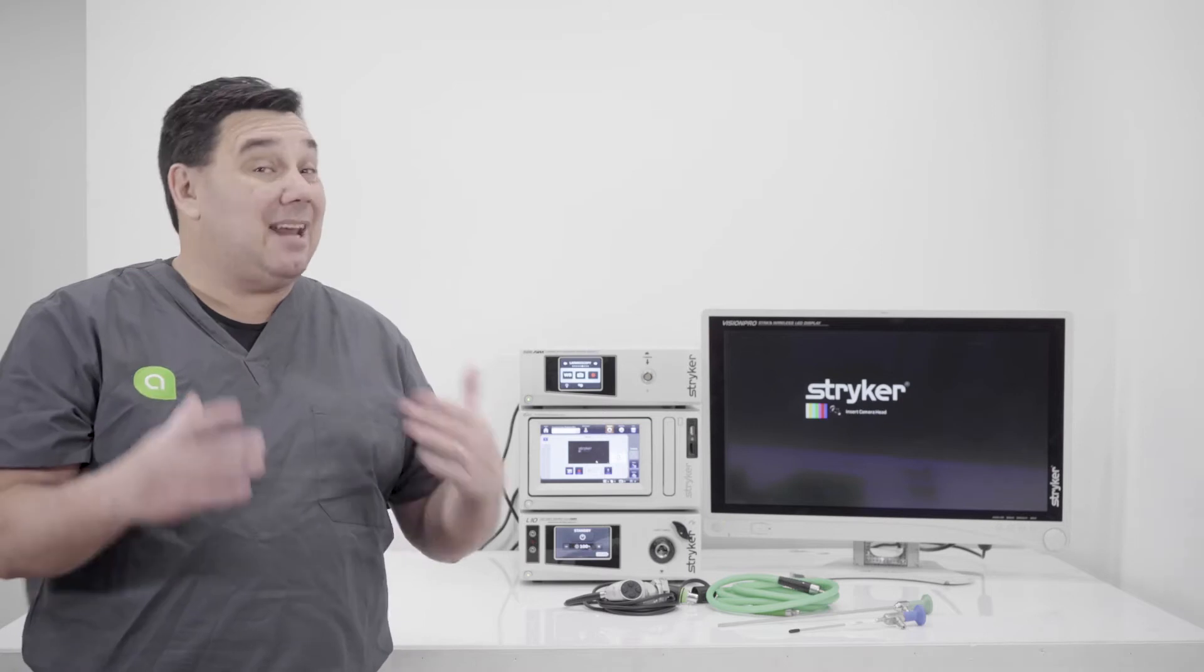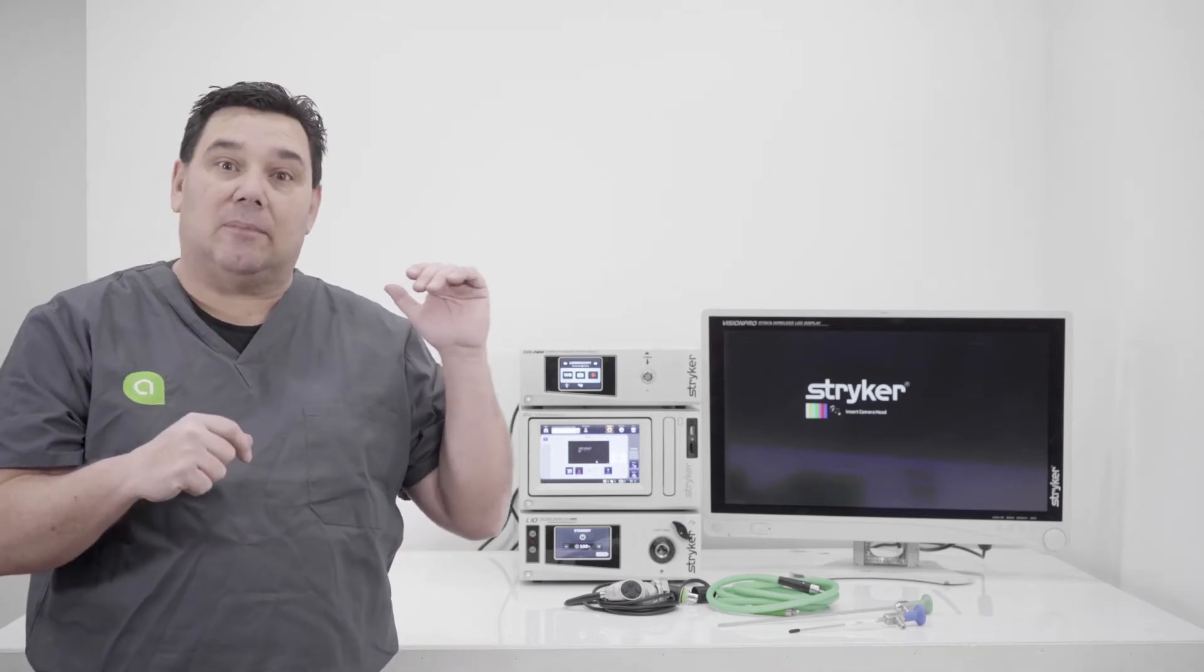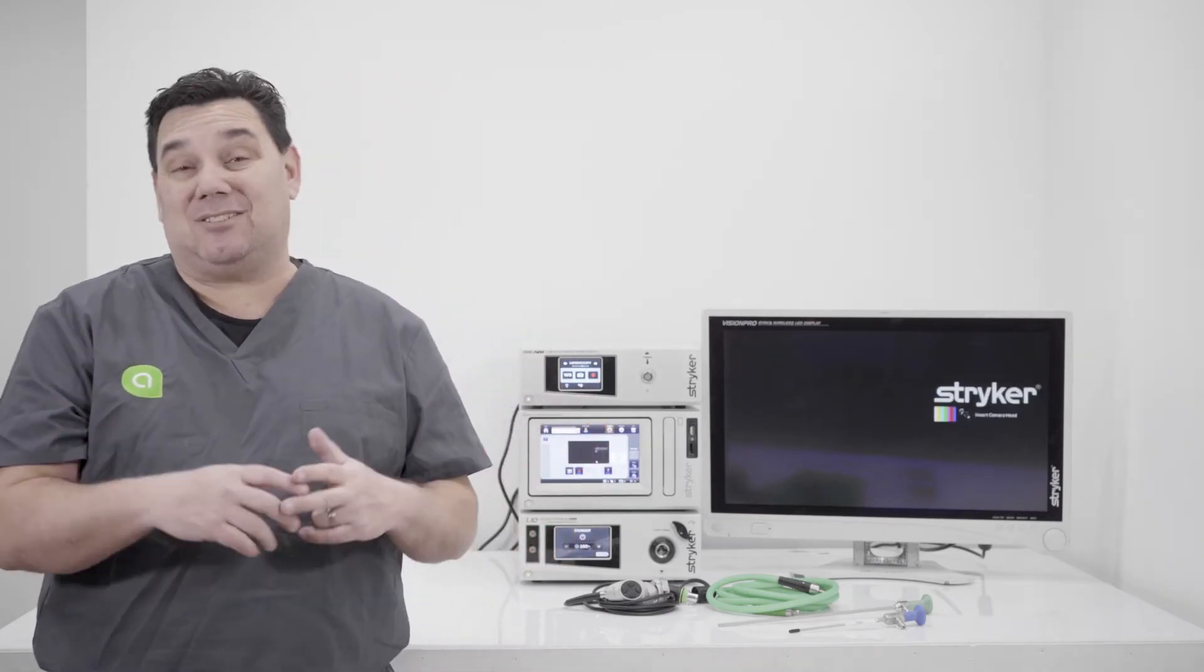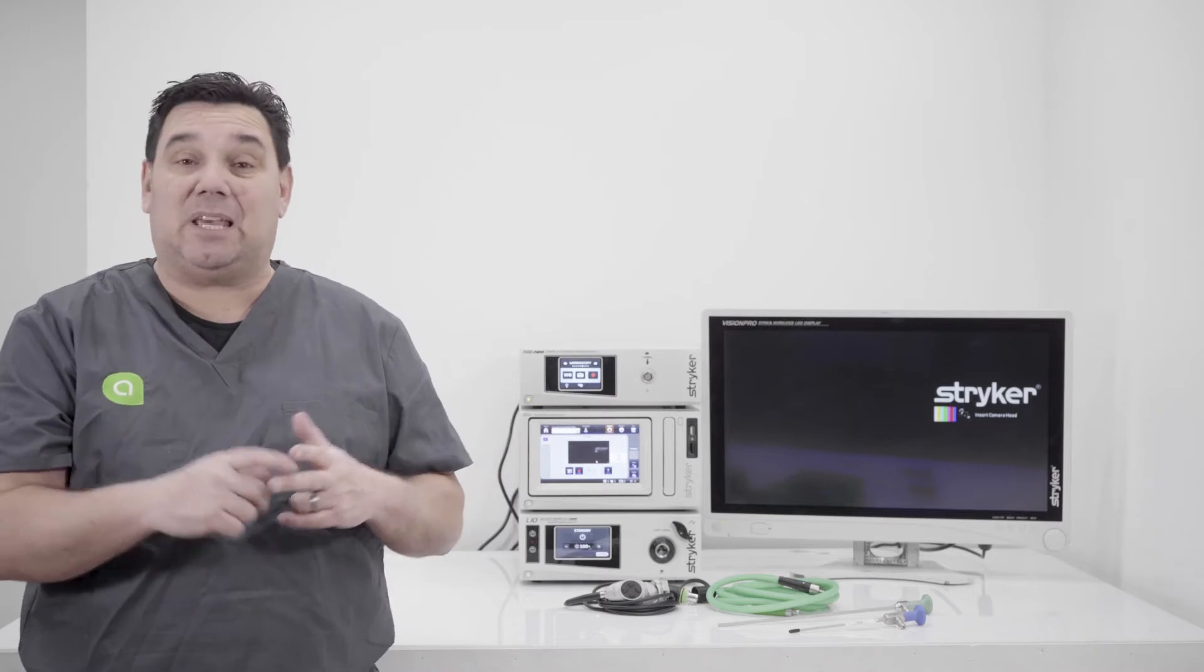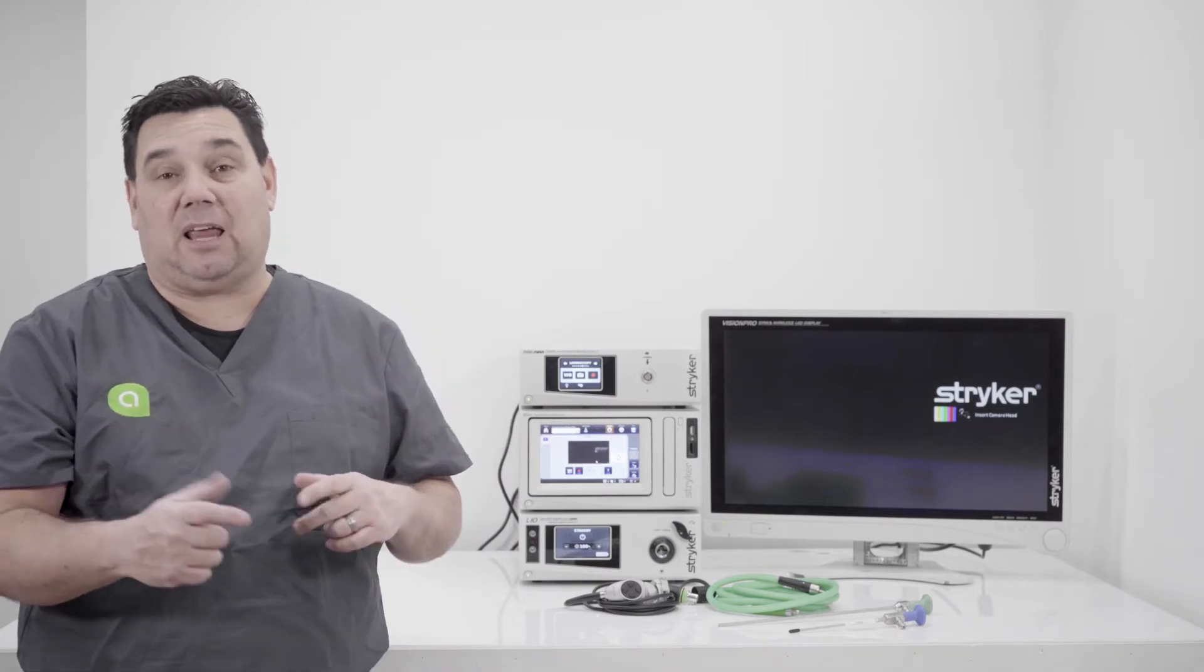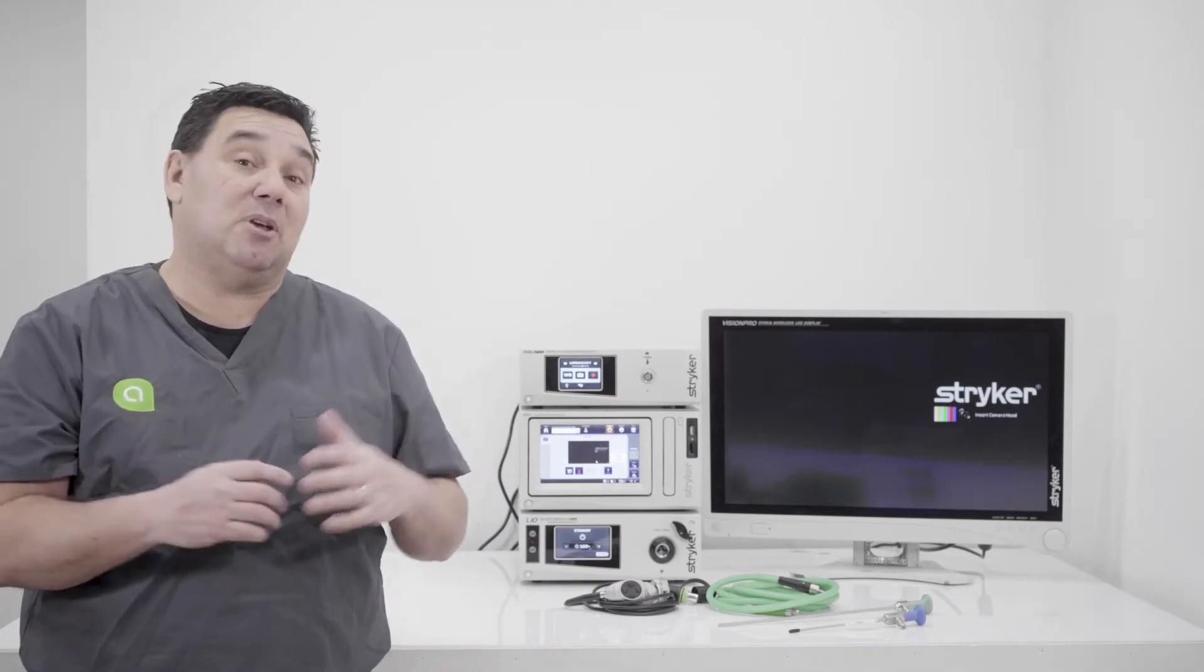Now, the nice part about the Stryker is that you can remote control from the Stryker camera head to activate or standby the light source. And it's just a USB cable that goes from the CCU to the light source to makes those two communicate.